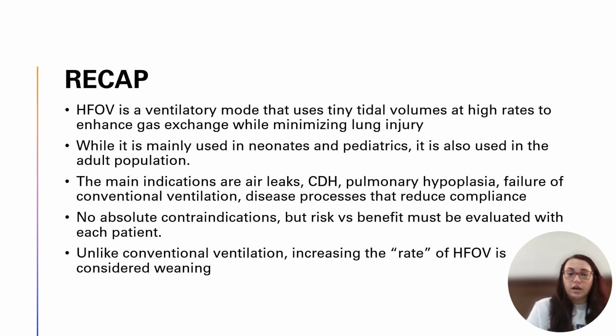Indications: air leaks, diaphragmatic hernias, pulmonary hypoplasia, failing conventional ventilation, and any type of disease process that decreases lung compliance. There's no absolute contraindications, but you have to think risk versus benefit with every single patient and take it on a case by case basis.